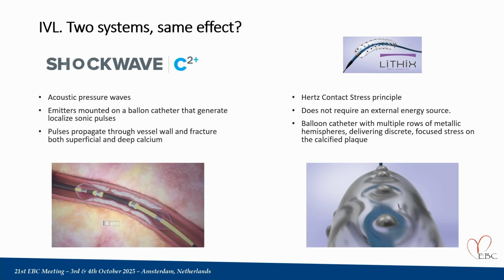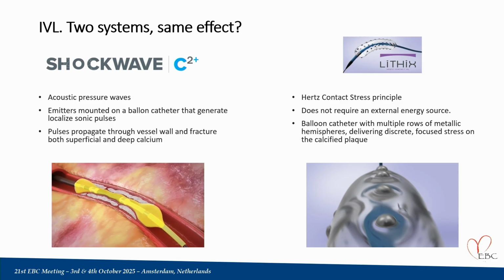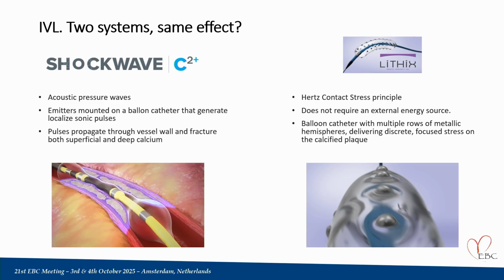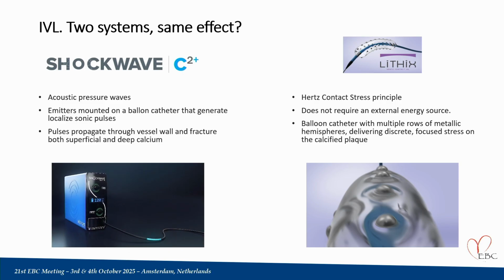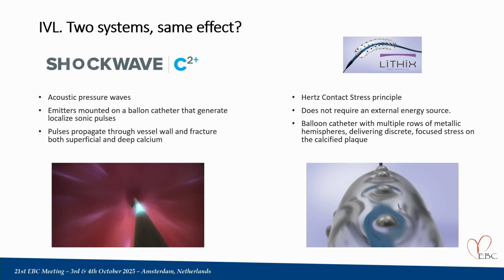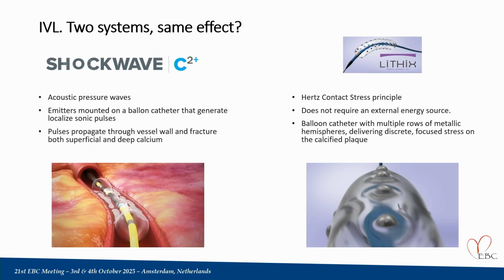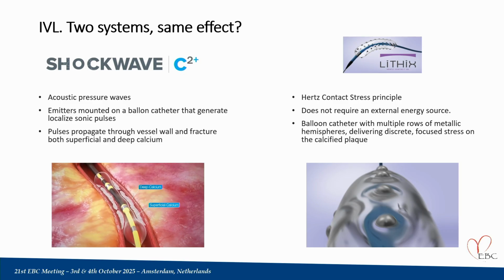These cracks are produced even on the superficial aspect of the calcification, but also in deeper layers of the calcification, allowing the balloon to expand progressively with the administration of subsequent pulses. We have the LithiX system as well, which is also an intravascular lithotripsy system, based on a completely different mechanism. It's based on the Hertz contact stress principle. The balloon has spheres mounted on it.